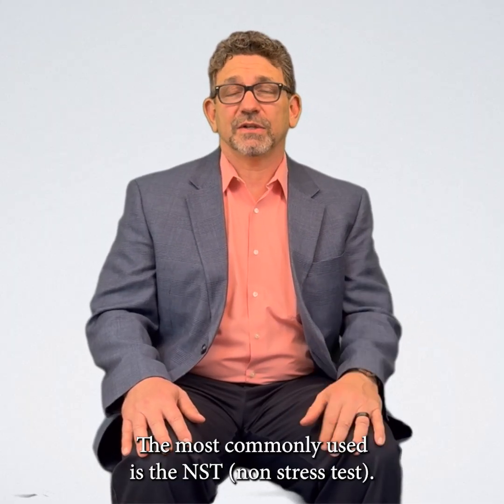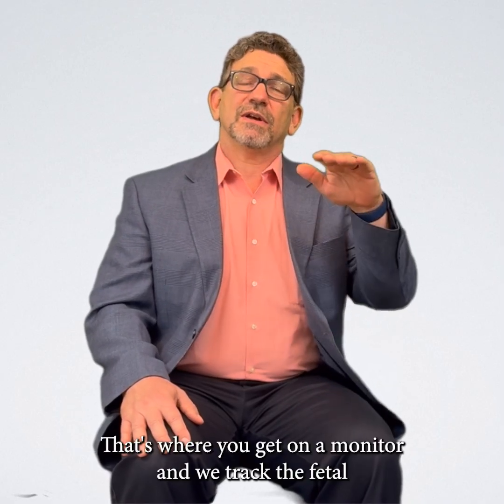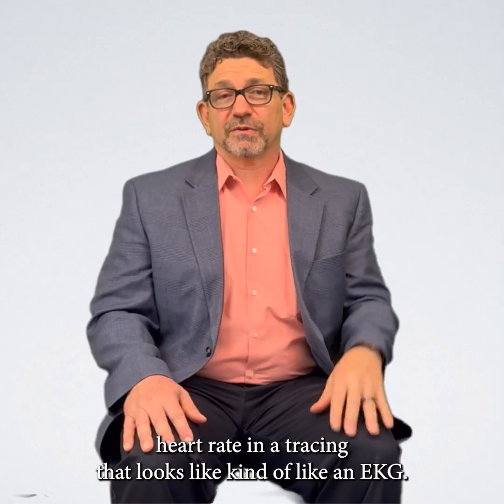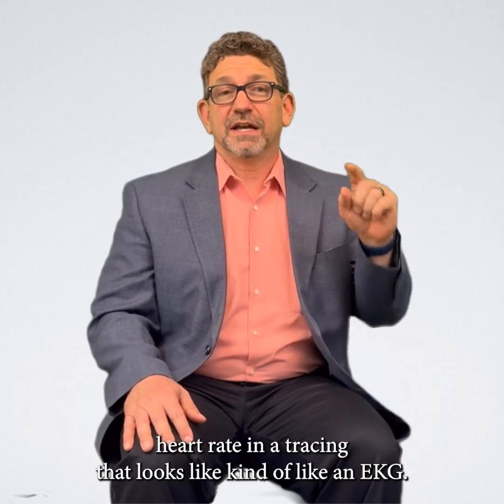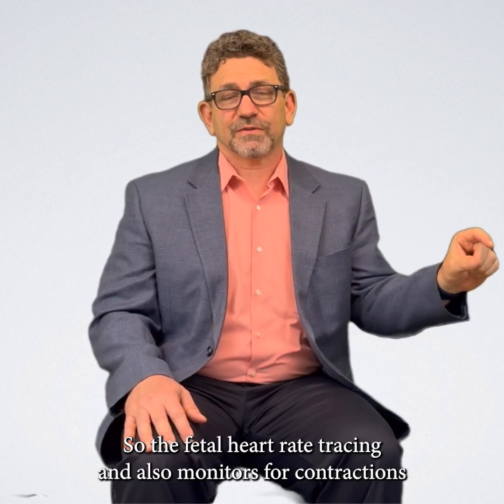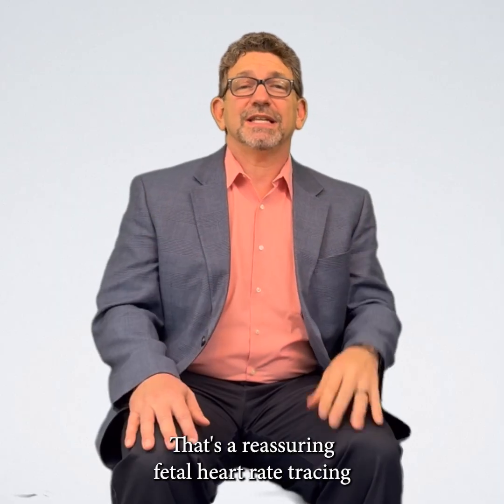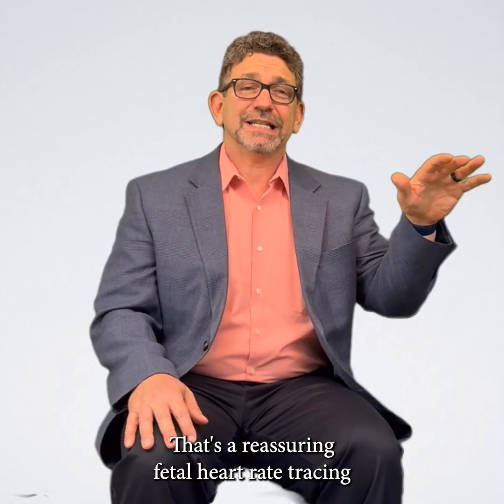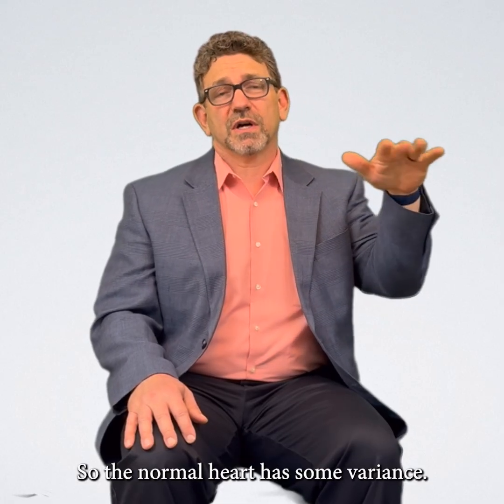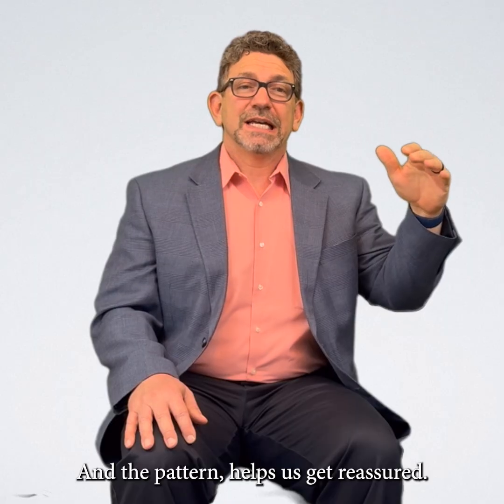The most commonly used is the NST, non-stress test. That's where you get on a monitor and we track the fetal heart rate in a tracing that looks kind of like an EKG. The fetal heart rate tracing, which also monitors for contractions, allows us to look for what's called a reactive NST. That's a reassuring fetal heart rate tracing that has certain characteristics of the heartbeat with acceleration. So the normal heart has some variance, and the pattern helps us get reassured.